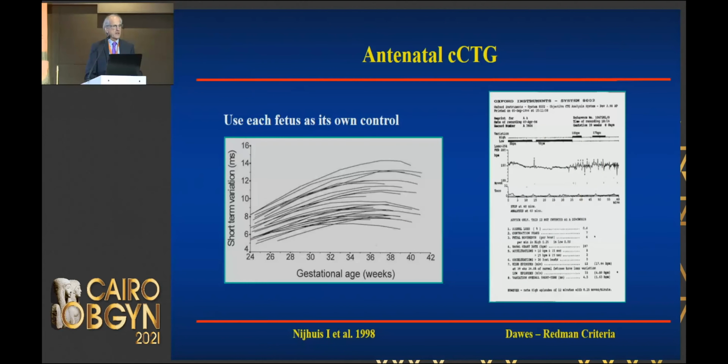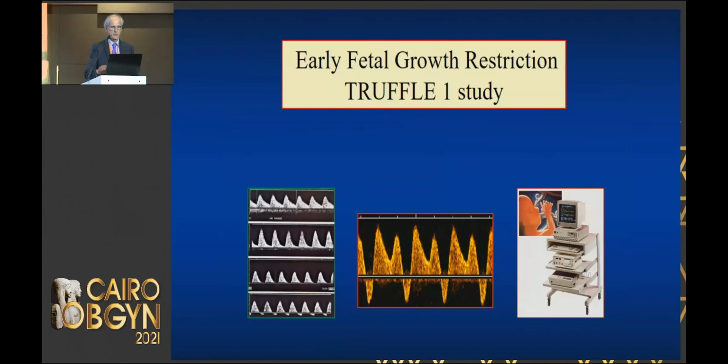And then at the end of the day, you get a protocol printed out from your CTG, which analyzes the basal fetal heart rate, decelerations, accelerations, episodes of high variation, low variation, and the short-term variation. And this is very important.